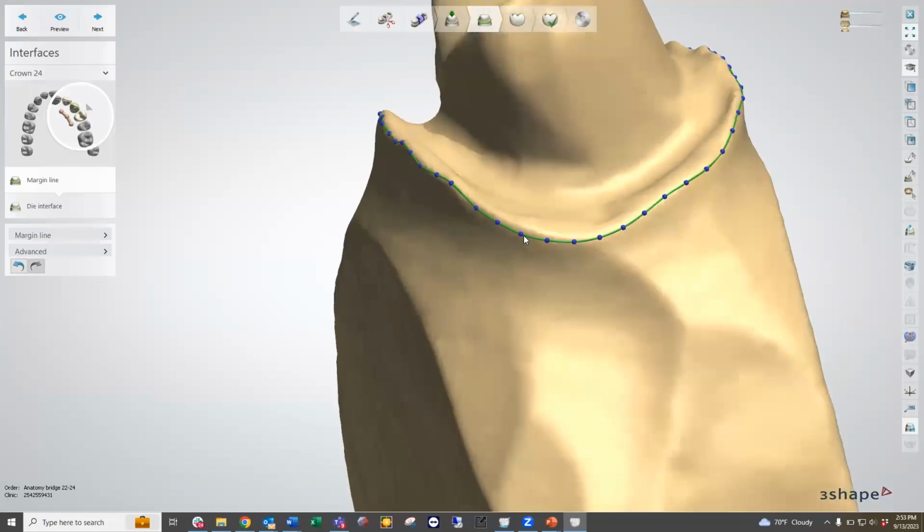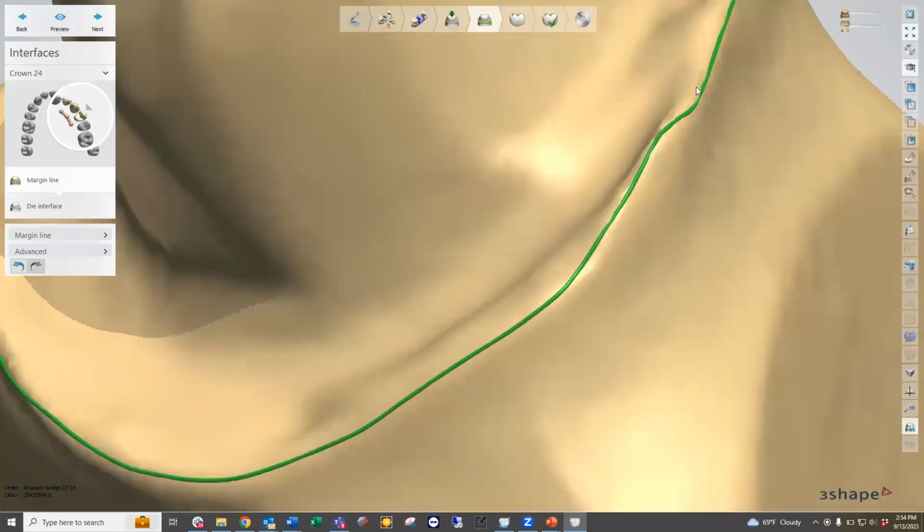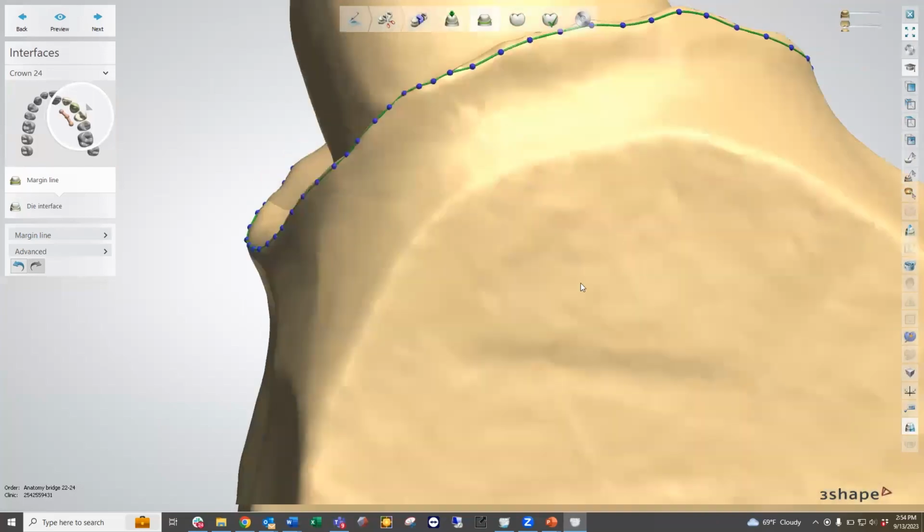Sometimes it is faster, though, to go to the fast edit line. Just highlight the area that you're looking to change, especially if it's a large change like what I just did. It's easier to do the fast edit spline and then go back in with the points to do a more gradual or accurate change, I should say, not individual.